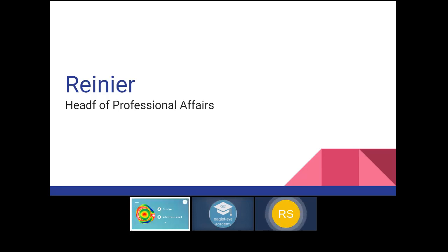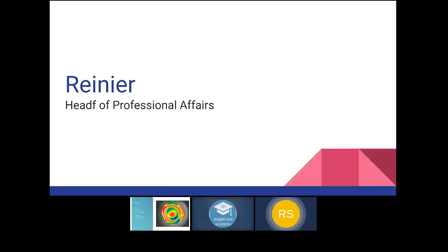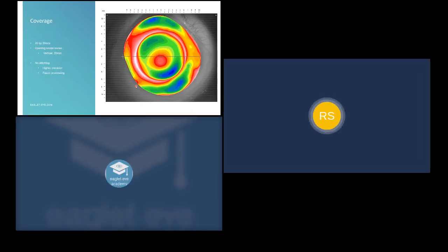All right. I will start talking about the coverage and how you take a scleral measurement. And what Tom already pointed out, we can measure up to 20 millimeters, horizontal as well as vertical. We believe that the eyelids are not really that big a problem. You have to open them very well. But the vertical opening between the orbital bones is 35 millimeters, so that's much more than the 20 millimeters we can measure.